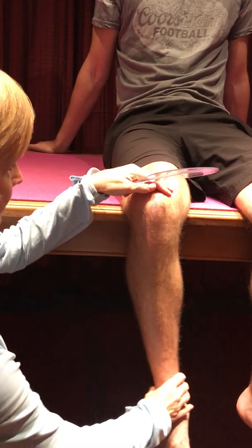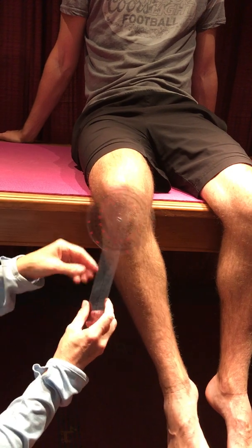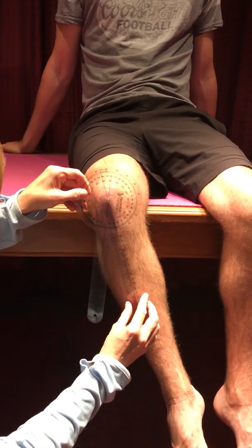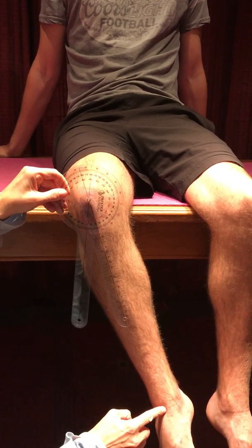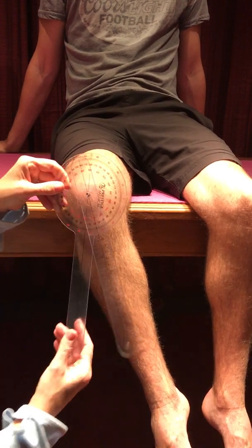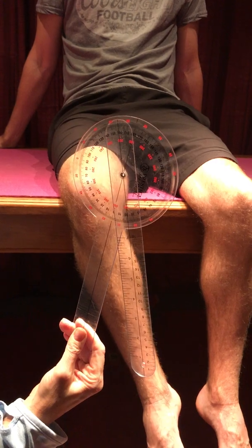Now we'll do external rotation — bringing the foot inwards but keeping the femur in place. Moving the goniometer so that we're in line with the tibia, aiming right for that mid ankle joint. And there we've got just over 20 degrees of external rotation of the hip.